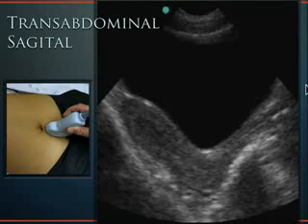Now, if I took the intracavitary probe, or the endovaginal transducer, and I inserted it into the vaginal vault, I would eventually come to the cervix, and when I land on the cervix, that's when I stop inserting the probe. The sound comes out over this whole area right here, and I get really high-res pictures of the uterus and the pelvic contents, because I've got that high-frequency transducer. So I'm just kind of throwing this all out there for anatomy and stuff.